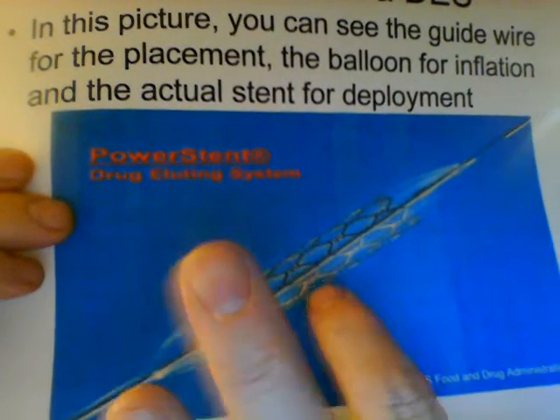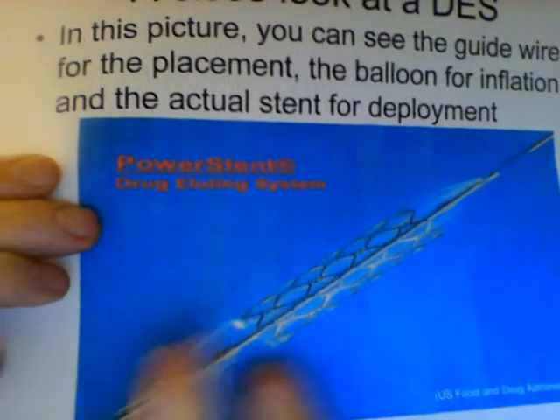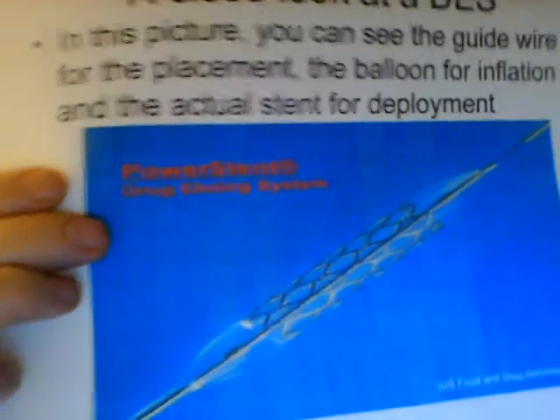The guide wire is run up into the cardiac arteries. The balloon is inflated. Then you have the stent that will expand. The balloon is then deflated. Everything's taken out and just leaves the stent behind, and that is what is left in place to keep the arteries open, push plaque away, and help bring the blood flow back to the heart, to that part of the heart that was potentially damaged.